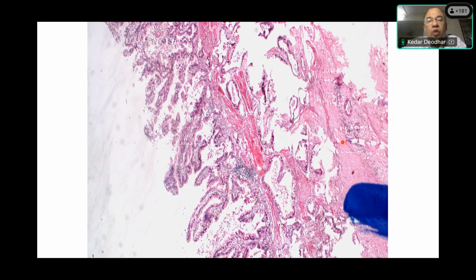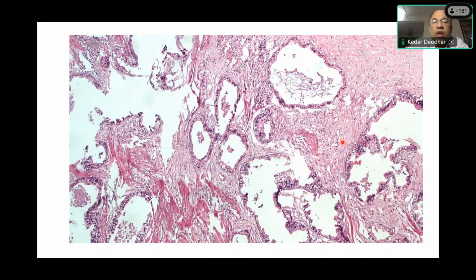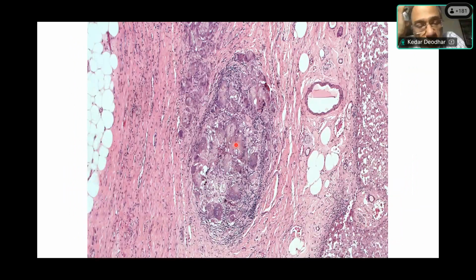Again, an example of PT2A gallbladder cancer, adenocarcinoma, moderately differentiated. And typically in the revision cholecystectomy, meaning the gallbladder is removed and we found cancer, the surgeon has gone back to resect the gallbladder fossa area and the local nodes and part of the liver parenchyma. Here in this slide, on the right side, we have liver parenchyma, which is non-tumorous.